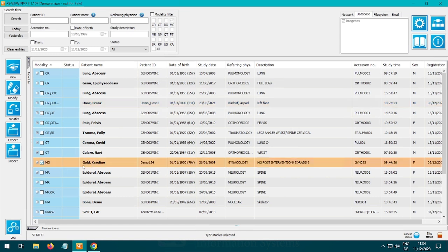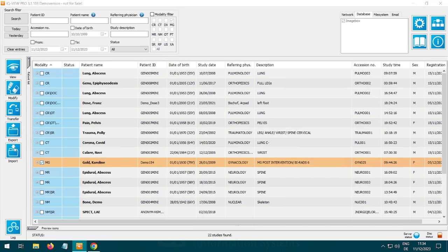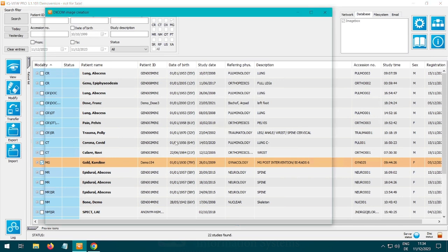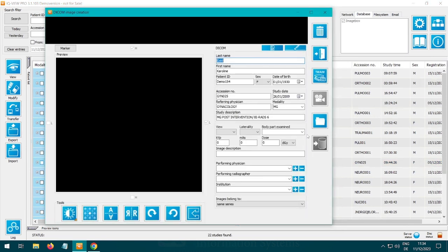Select the study to which you want to add the PDF. Drag and drop the study onto the import button. The import dialog will open.